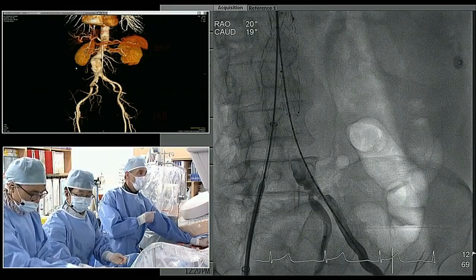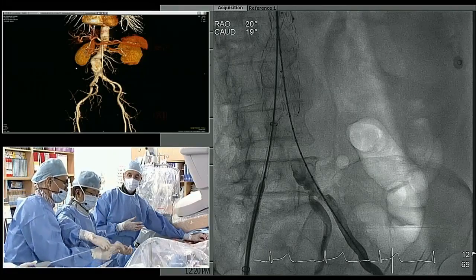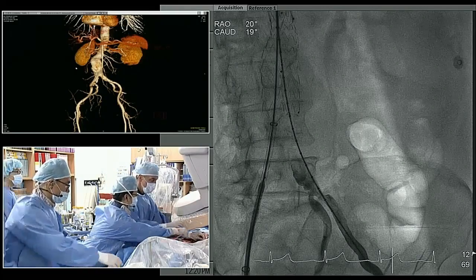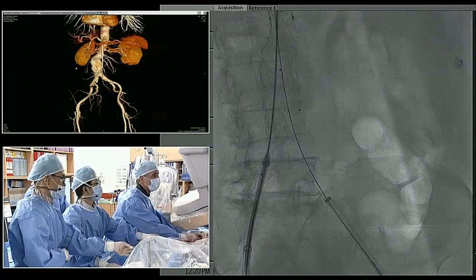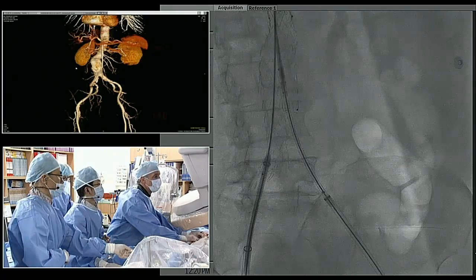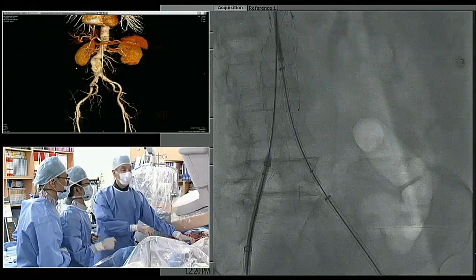We have a 20/20 caudal contralateral view that really opens up that bifurcation really well and allows us to see it without any equivocation. I don't know if you use that in your lab or not. Sure, the contralateral and then adding caudal is often helpful. Not always needed on the AAAs, but in this case, it looks like it's very helpful. So we like that right there?